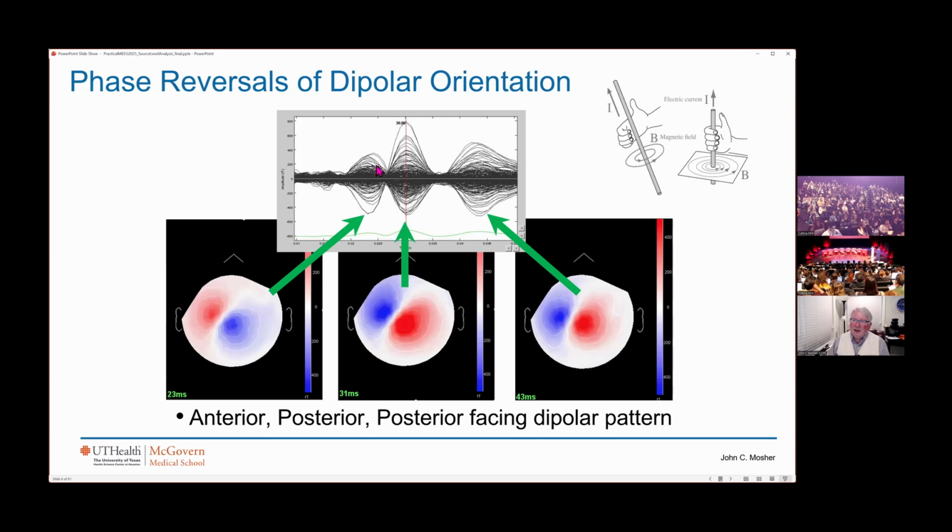And if we just look at this data from a sensor level, a sensor map, or a brain map, as it's sometimes called in the clinical software, we're just taking these patterns and looking at the pattern it creates, in this case on a flattened helmet. And we see immediately the very classic current dipole pattern. So holding your right hand out, diving in, blue is negative and red is positive. You can do your right hand and realize that this one has to be an anterior facing dipole. So you don't even need to do source localization at this point. You're already seeing this is anterior facing.